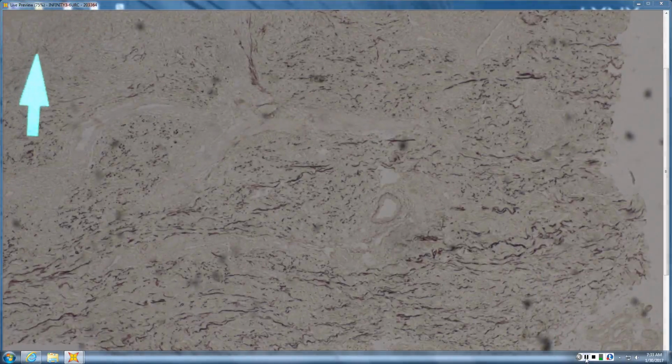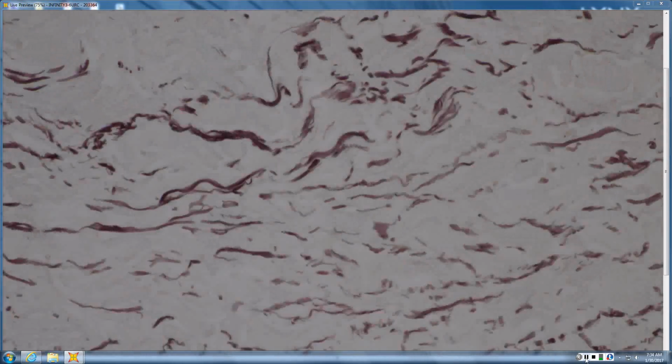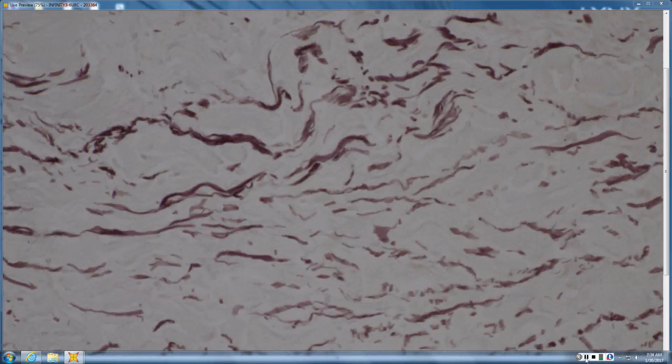Okay, well, I'll walk you through this one. Epidermis is about normal. Dermis is somewhat attenuated because the glands sit very high, the secretory coil. The elastic tissue looks relatively normal. And collagen, which you see just as a negative background, is very much attenuated.